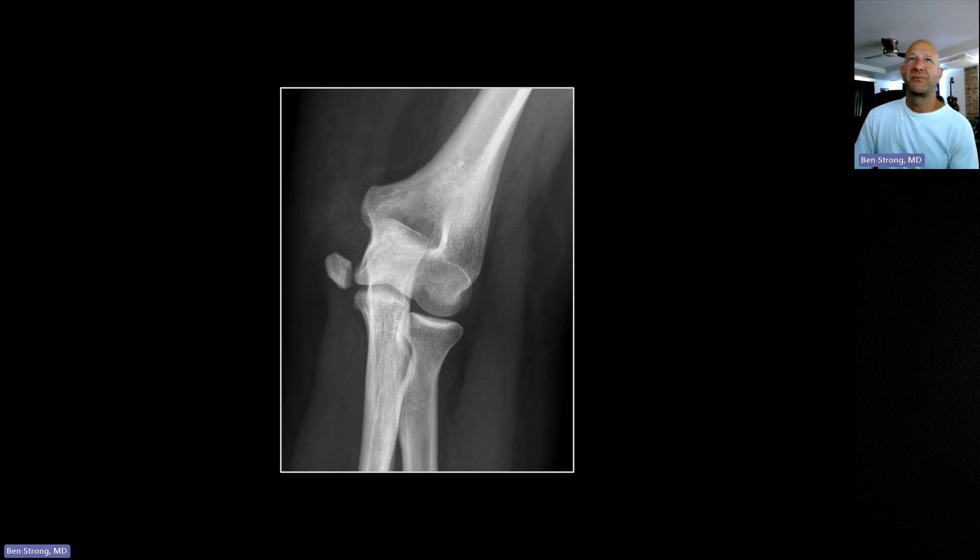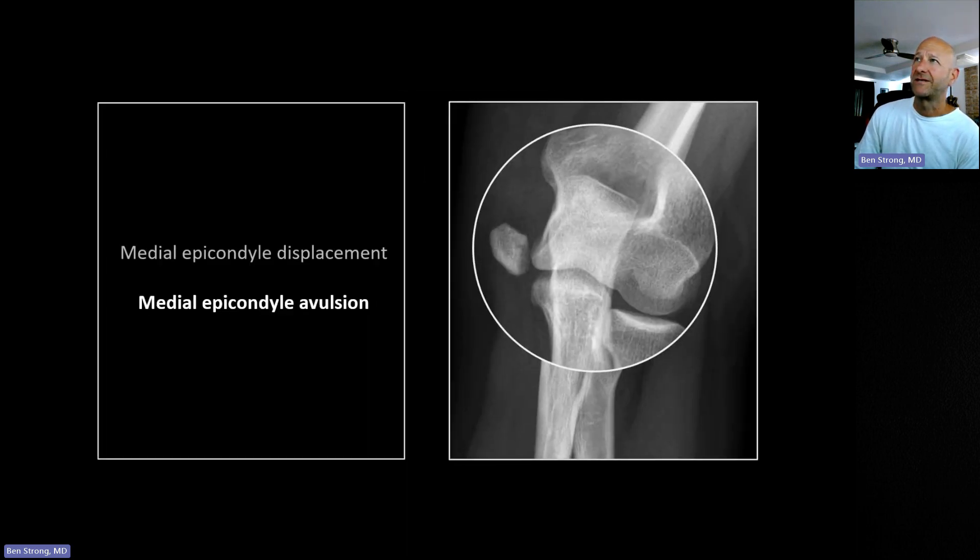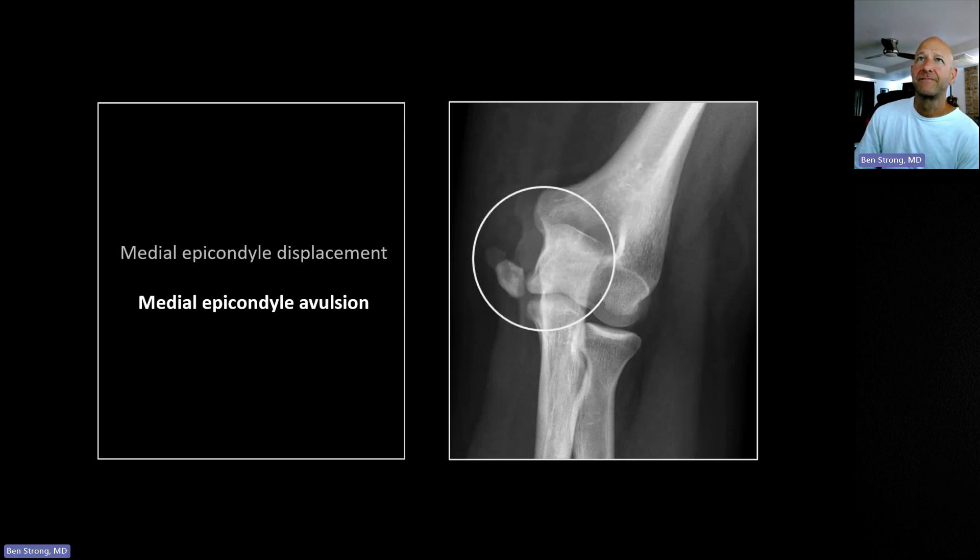This case is included because it's unusual: a medial epicondylar avulsion in an adult. This is typically a childhood injury because the growth plate there has not yet fused. It may be the only one seen in an adult, and one wonders whether the growth plate was incompletely fused to begin with.